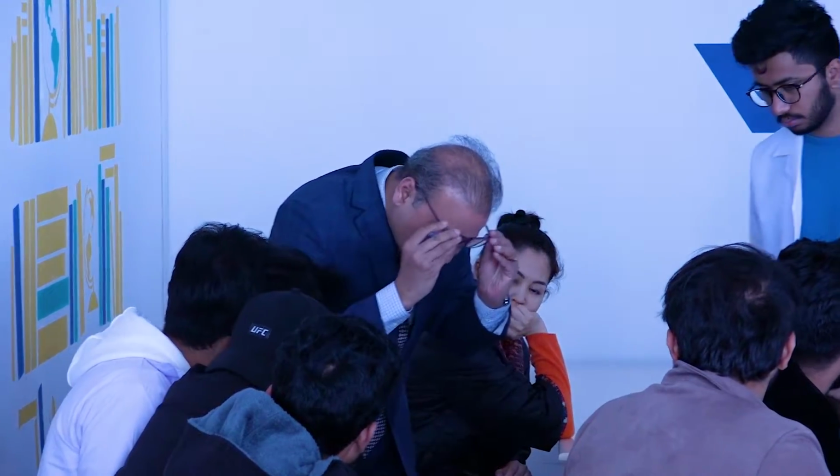Okay, you just see. Here is P, here is Q, this is R, S, T. Total one complex. This is called a complex. Here is Q and T finishing. In between QT, it means depolarization and repolarization.